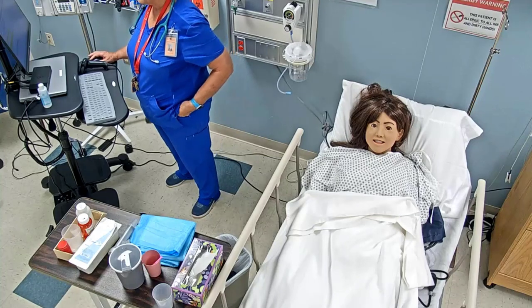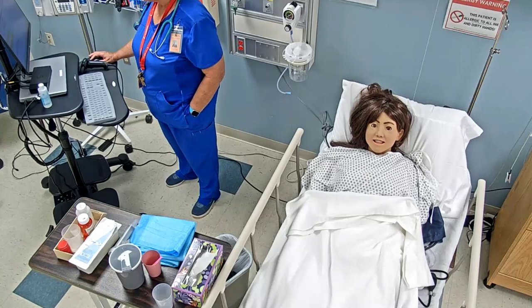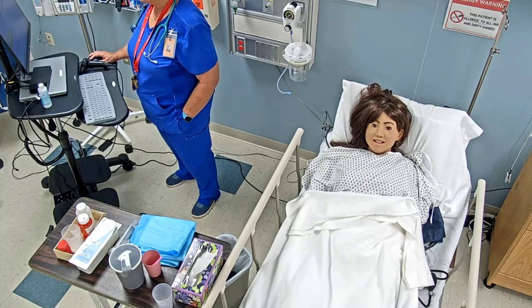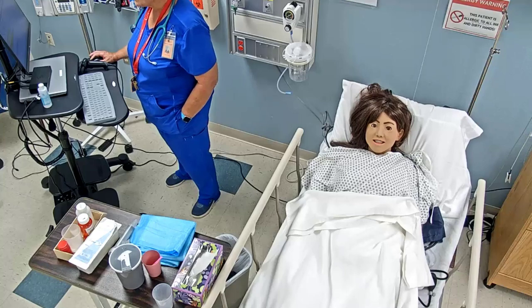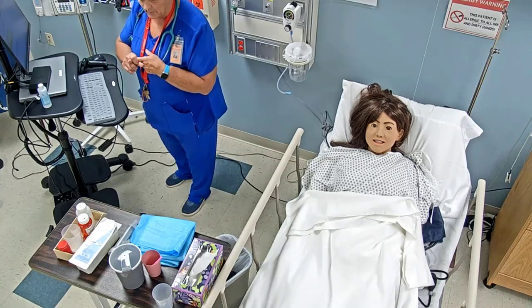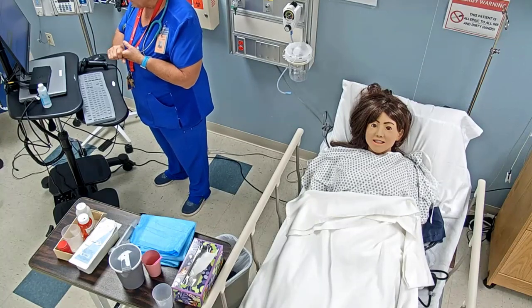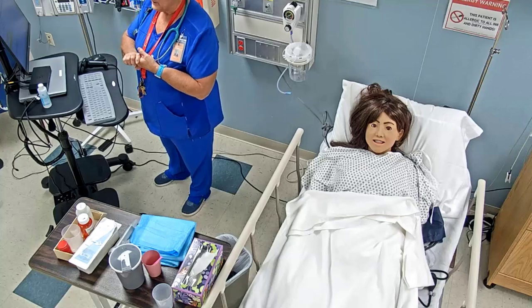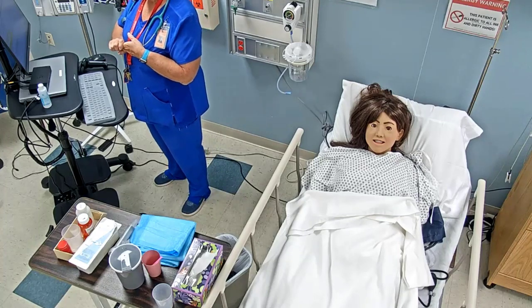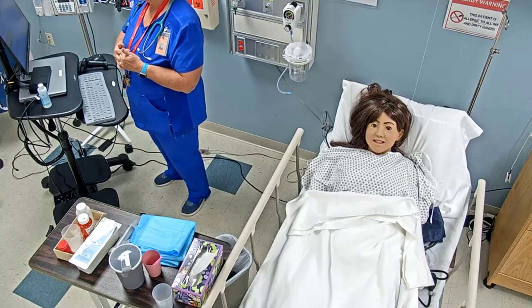O on that, okay? So once we've checked the doctor's orders, another thing that I'm going to be looking for in my doctor's orders, or just in general in my chart, is any significance in vital signs, any labs I need to be paying attention to. I'm going to be looking at if they've had any kind of side effects or problems with any of the meds that they've taken so far.